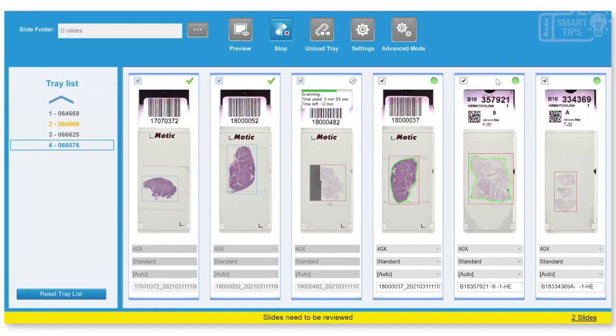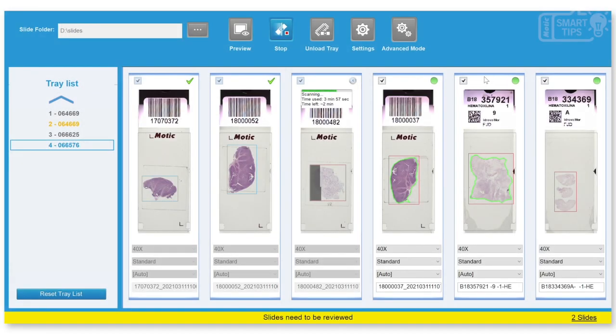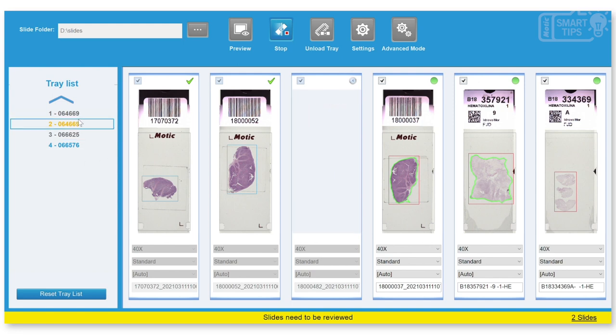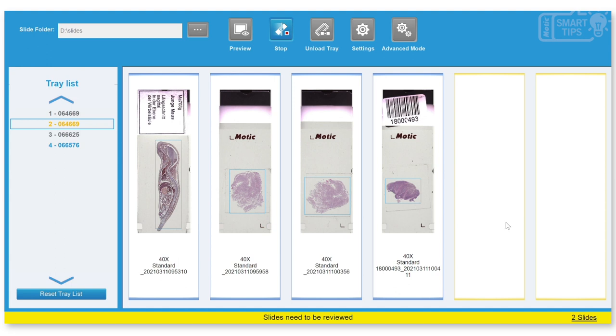Okay, so while this is scanning, I will return to the slides that were scanned first, which are the slides that we loaded. As you can see, the text appears in yellow and this is because there is important information to be reviewed in this tray. And the thing is that the last two slides were left empty, of course, purposely, but the scanner doesn't know this. So that's the reason that they appear in yellow. It's to inform you that there is something different about the slides and that you need to review it.